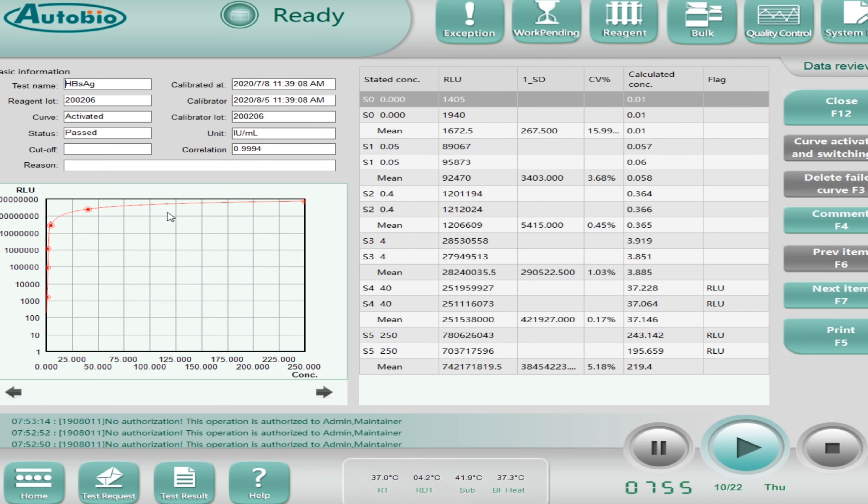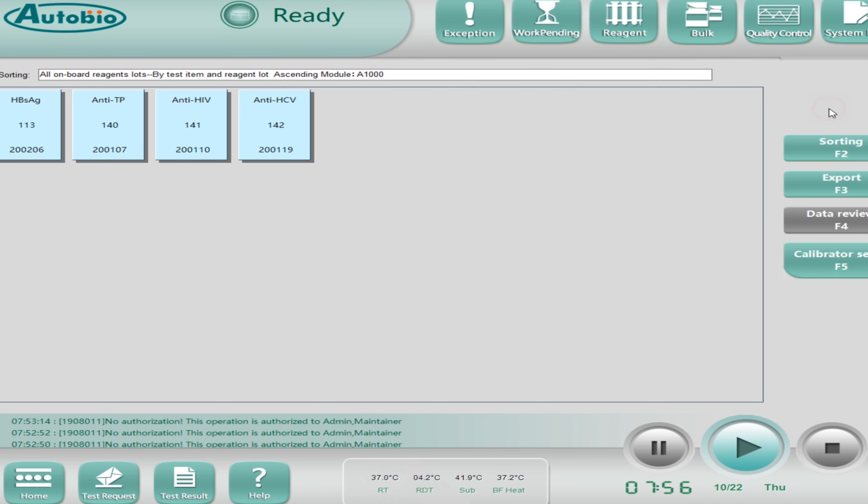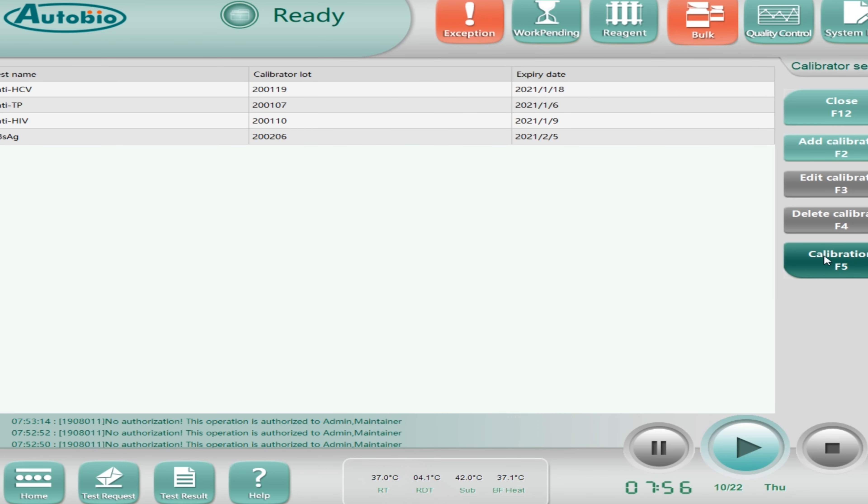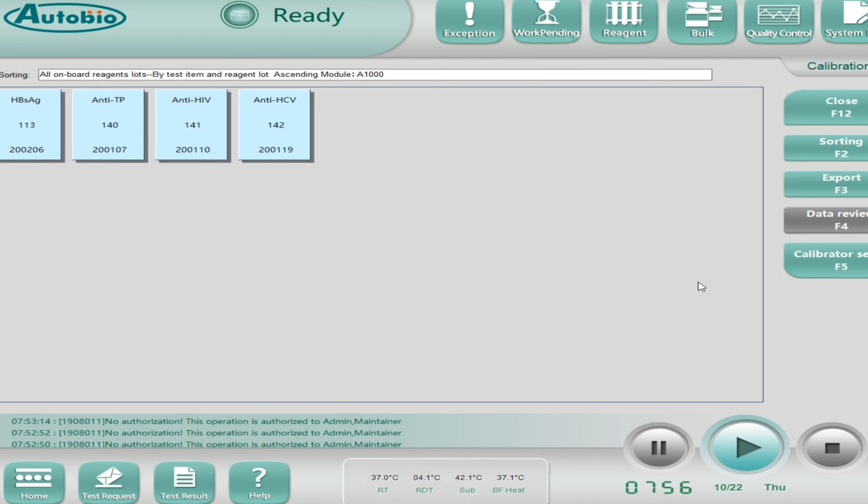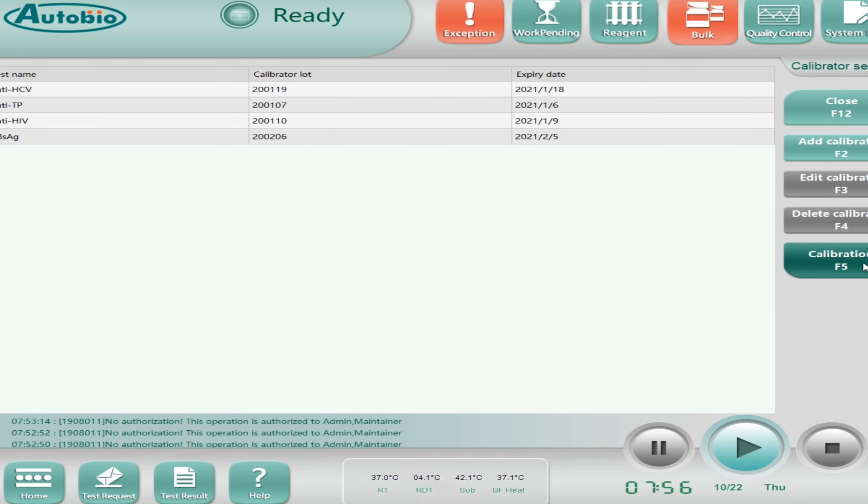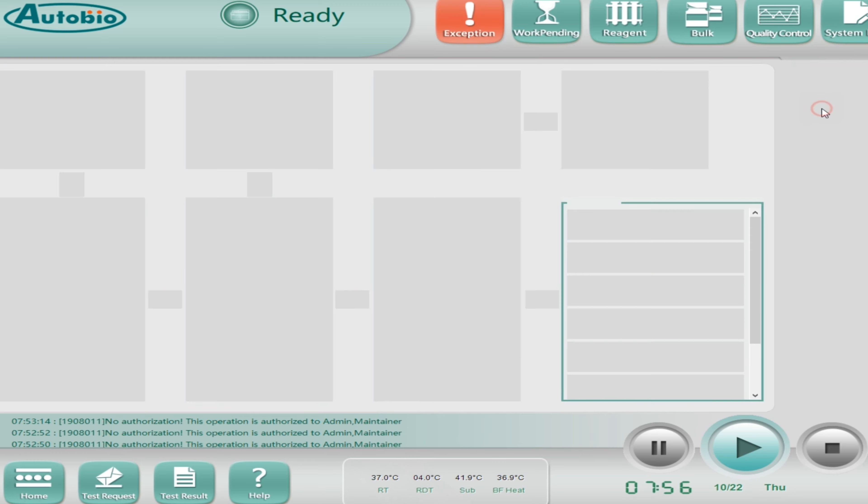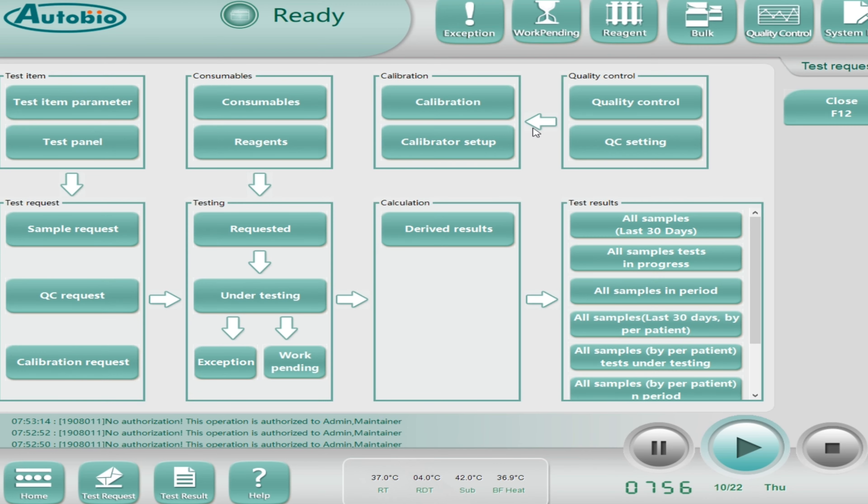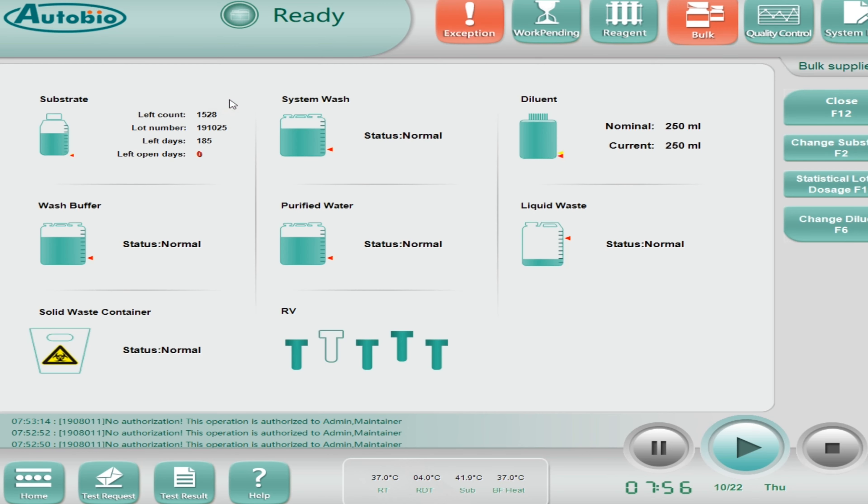If you want to review the chart, just click on review chart and you can see the chart is here. This is your Levey-Jennings chart. Same as if you want to add the QC, just click on QC setting and you can click on add QC. If you want to do the edit, you can click on edit option. From here you can feed the new values.